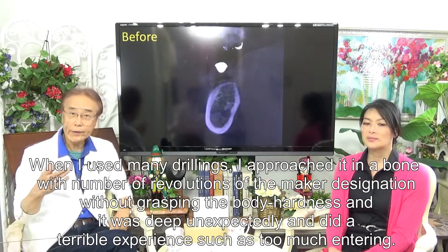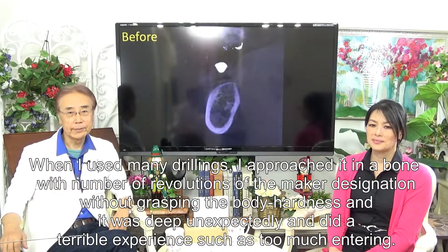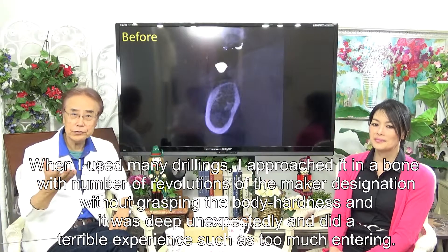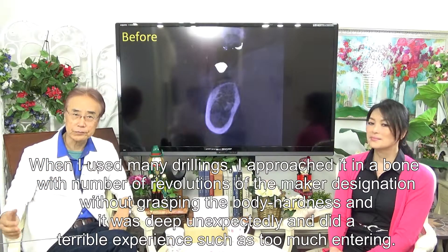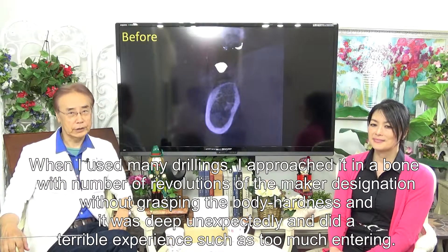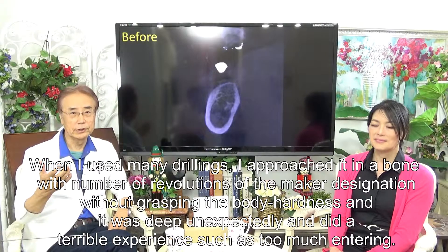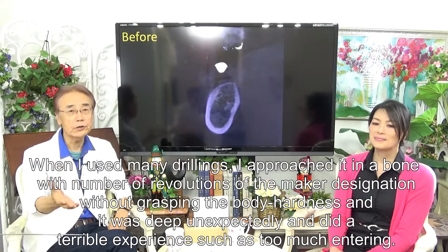For your information: when I used many drillings in the past, I would approach the bone at the manufacturer's designated number of revolutions without grasping the bone hardness. As a result, I had terrible experiences such as the drill going unexpectedly deep and entering too far.